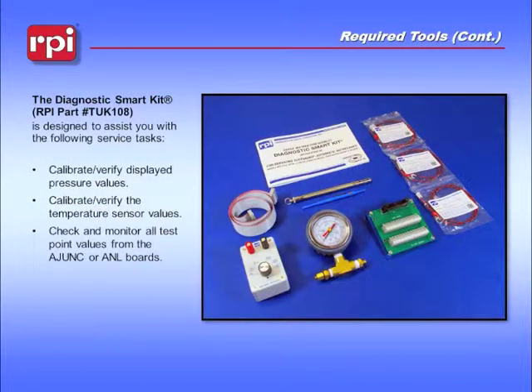The Diagnostic Smart Kit, RPI Part Number TUK108, is designed to assist you with several service tasks, including verifying pressure and temperature sensor values, calibrating the pressure and temperature sensor, as well as verifying voltages for various components on your machine.